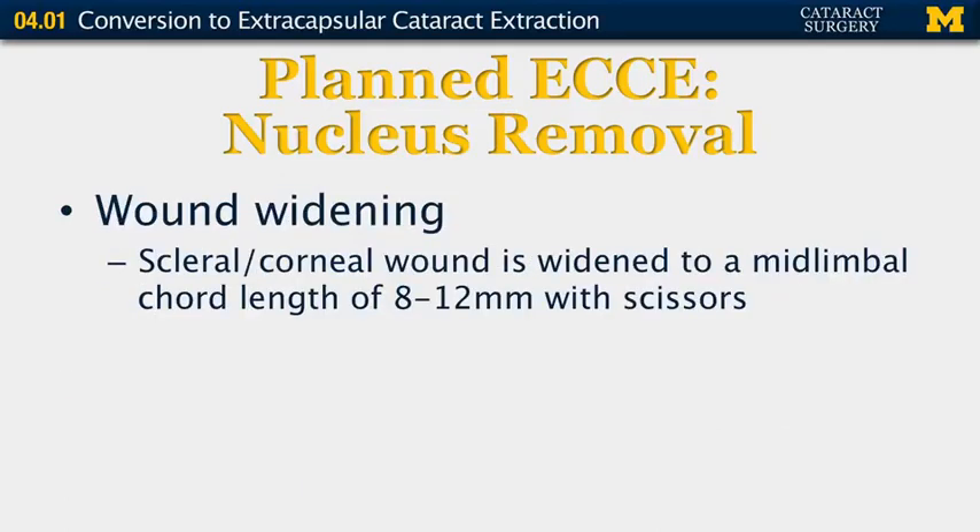At this point, you want to proceed with widening the wound. The scleral or corneal wound is widened to a mid-limbal cord length of 8 to 12 millimeters with scissors.